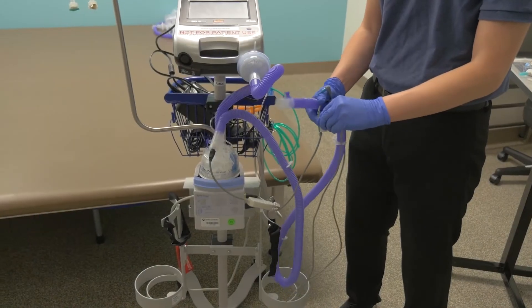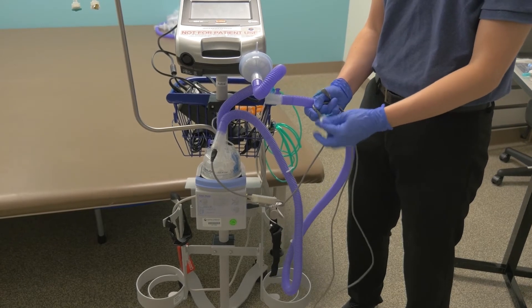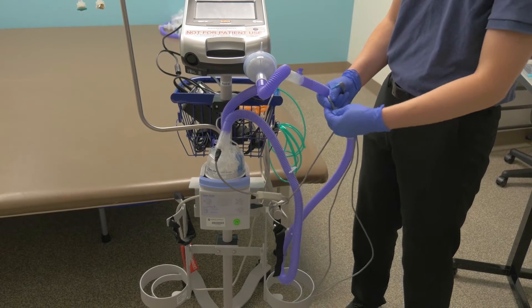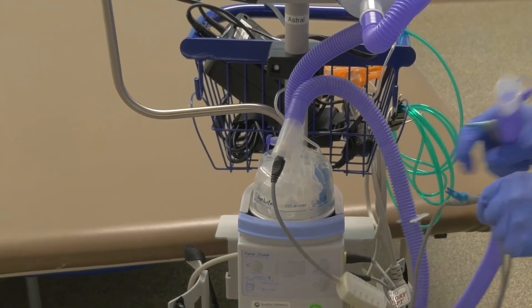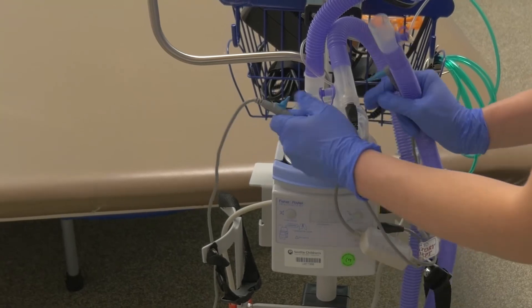Each water chamber has two temperature probes for those openings that should already be attached on the side of the device. Before placing the first shorter temperature probe into the circuit tubing, clean it for 10 seconds with an alcohol wipe. Next, take the shorter probe and place it into the correct opening, inserting it with the bump in the probe facing up.